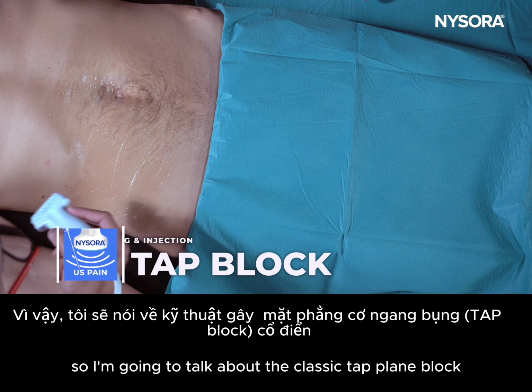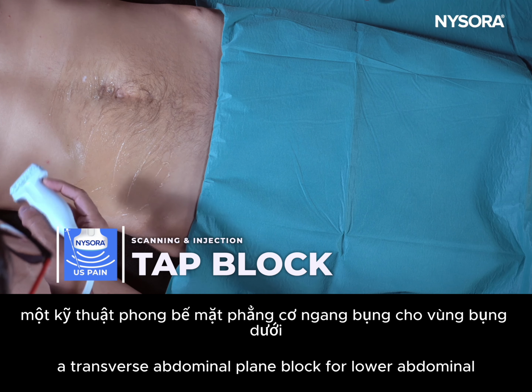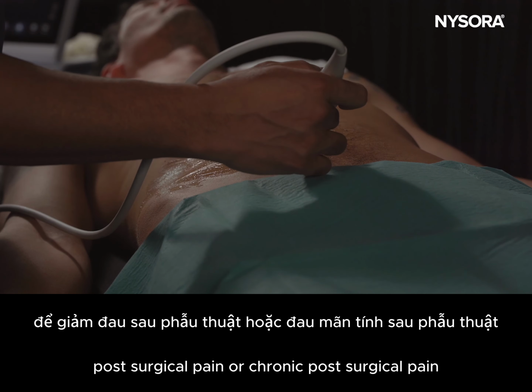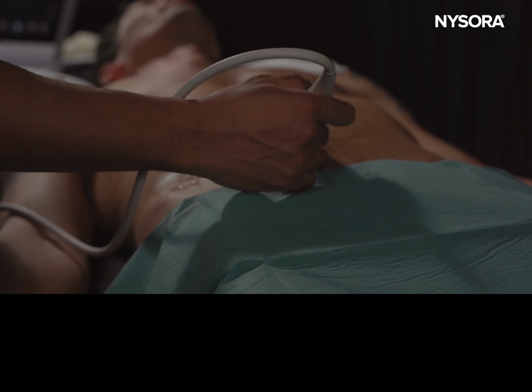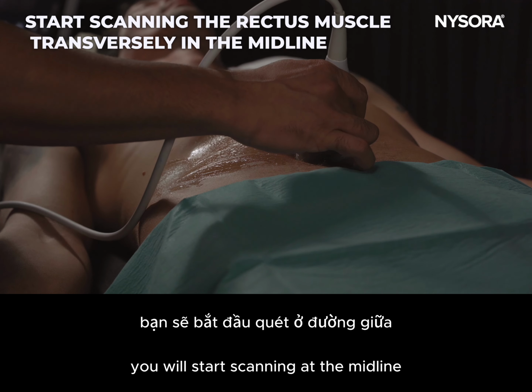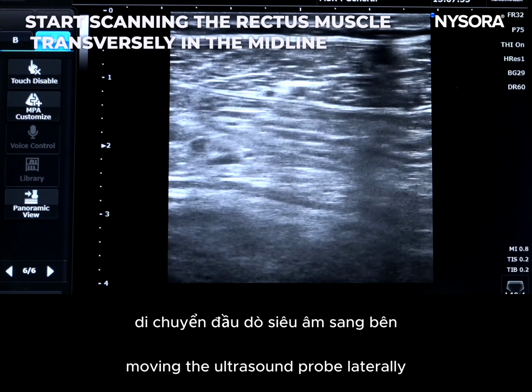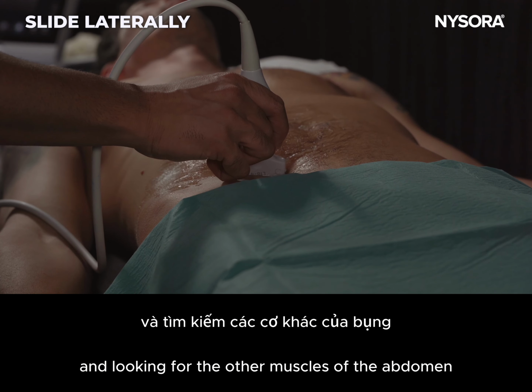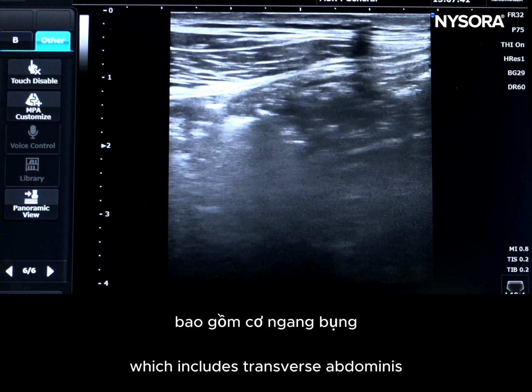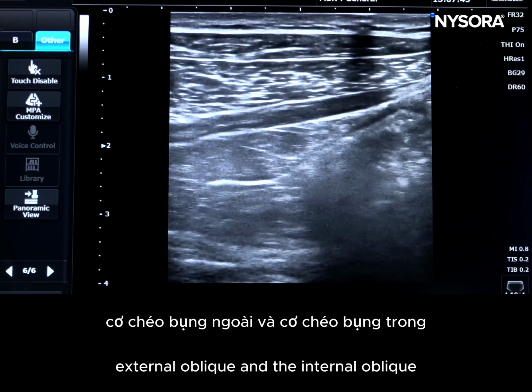So I'm going to talk about the classic TAP block, a transverse abdominis plane block, for lower abdominal post-surgical pain or chronic post-surgical pain, post-cesarean section pain. To perform this procedure, you will start scanning at the midline, looking at the rectus muscle, moving the ultrasound probe laterally and looking for the other muscles of the abdomen, which include transverse abdominis, external oblique, and the internal oblique.